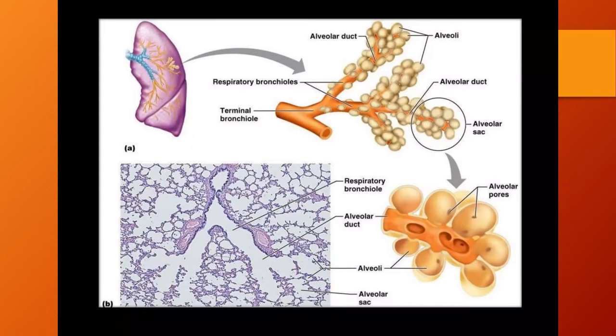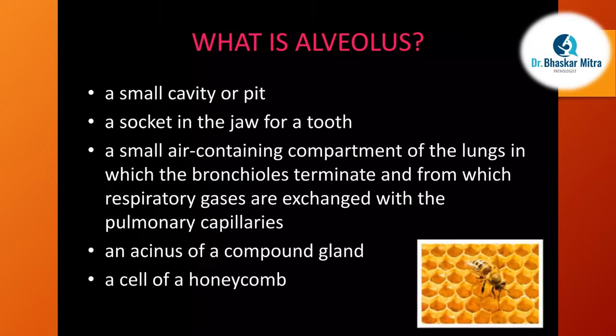Now comes the alveolar pattern. Where do we see the alveolus? We see the alveolus in our lung. This is the alveolar unit; there is an alveolar duct, an alveolar sac, and some alveolar pores. These are the air-filled alveolar sacs. When cells are arranged in such a large dilated glandular pattern, it is like an alveolus, and it all drains into a duct. It may be secretion; here it is air, but it may be secretion.